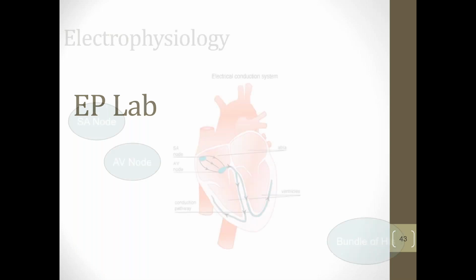EP lab. EP lab's kind of its own little world within the cath lab. It doesn't really matter with the machine itself, the X-ray machine, because it's basically the same machine they would use in cath lab or interventional radiology or any of those types of areas. What makes the EP lab special is all the other equipment that goes with it. And so we'll cover some of the things they do in the EP lab.